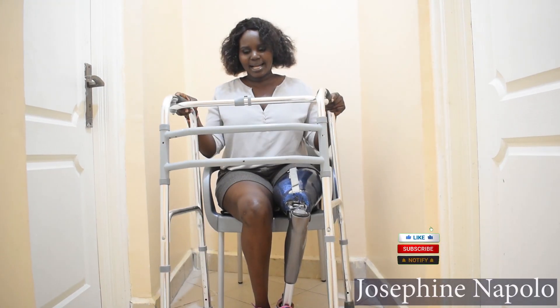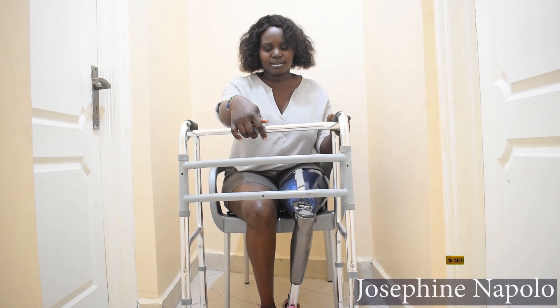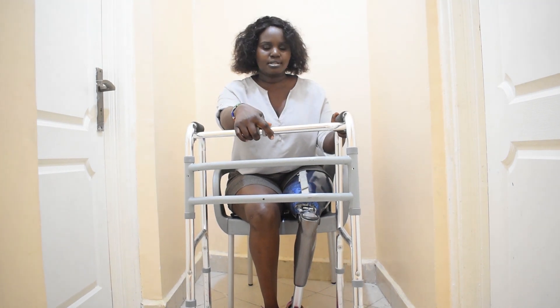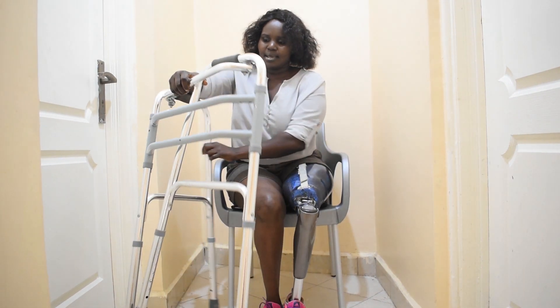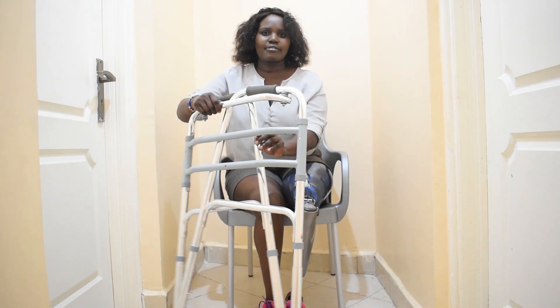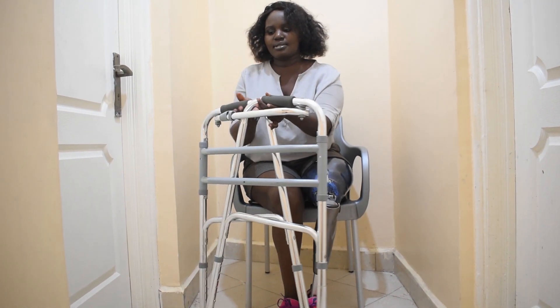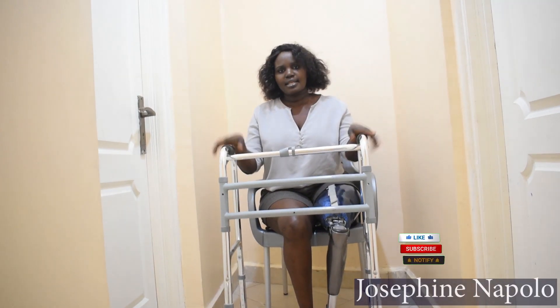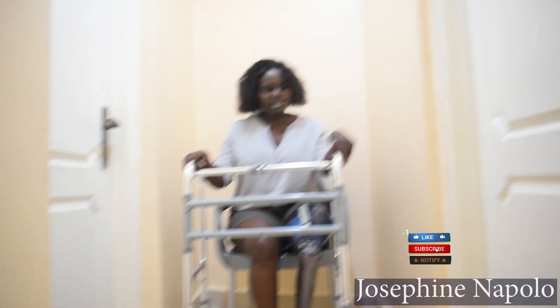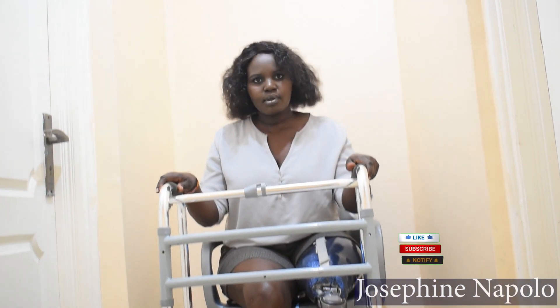So this is a walker and it has a button here. It's about the button where you can hold. You press in and fold it. So if you want to open, you just open without pressing and it opens. And here on my handles, these are the handles — very soft.